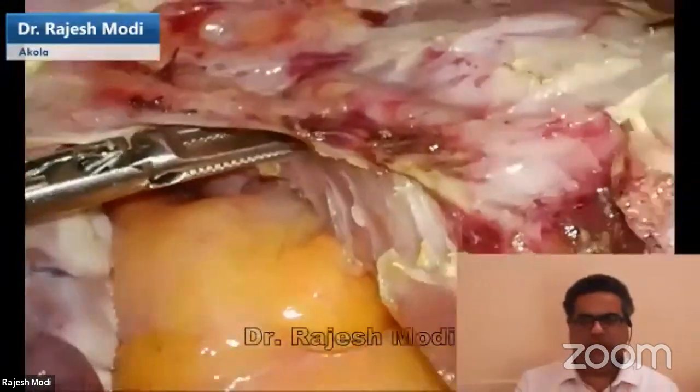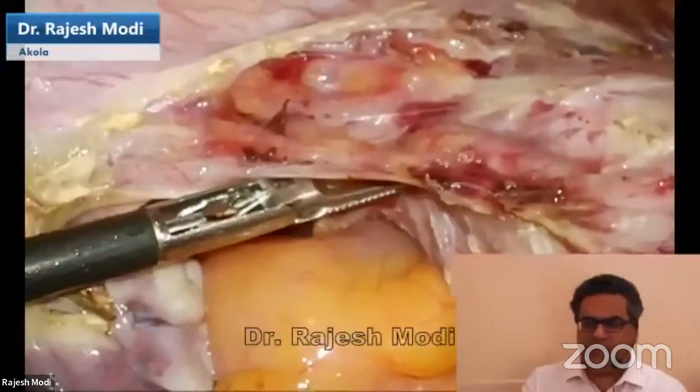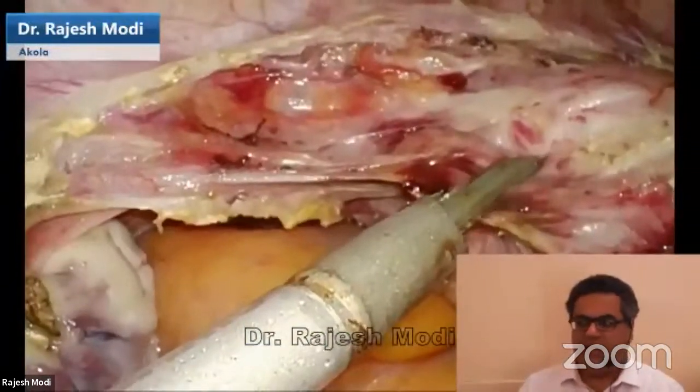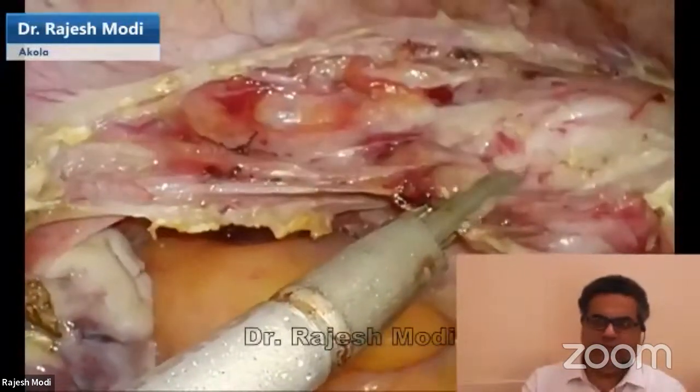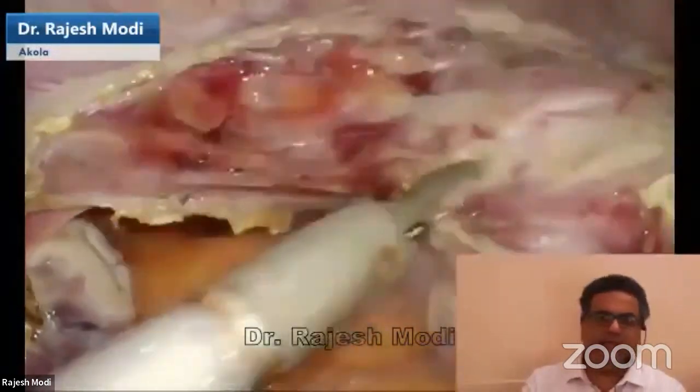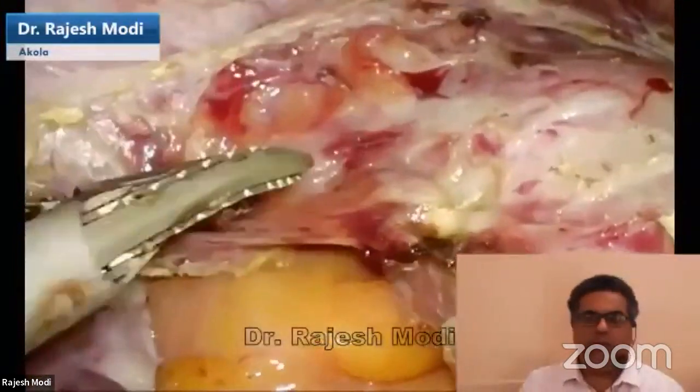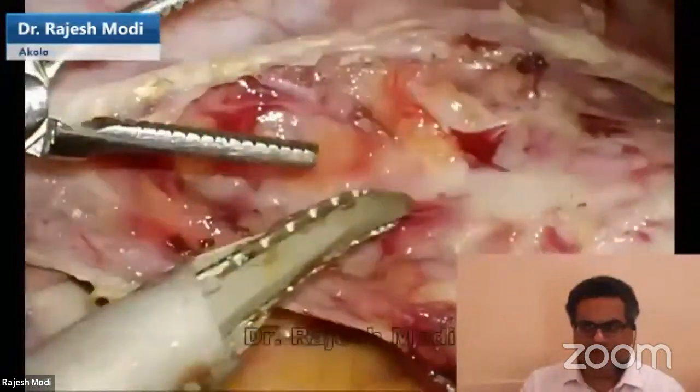But otherwise, benign gynec surgeries, again, I'm highlighting the same concept in the second video over here. This is with the Thunderbeat. I can very well coagulate and cut off in that area where I'm holding. You can see anteriorly, the bladder has gone down. Posteriorly, the broad ligament has gone down, but the pillar has not yet been dissected.